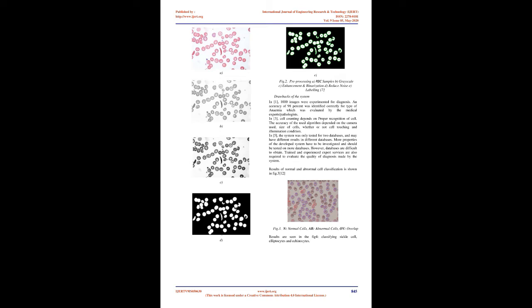3. Image processing is the technology of enhancing the quality of the image or to extract information from the image digitally, using computer algorithms. Here, input is an image and the output of image processing can either be an image or some parameters of the image. This process includes many steps: grayscale conversion, noise removal, image conversion to binary, filling the holes of these cells and clean incomplete cell and cells at the boundary, followed by removal of WBCs and platelets. Obtaining only RBCs for conversion and classification.